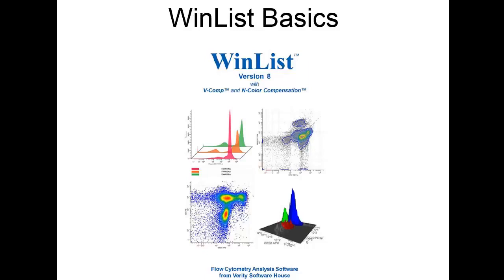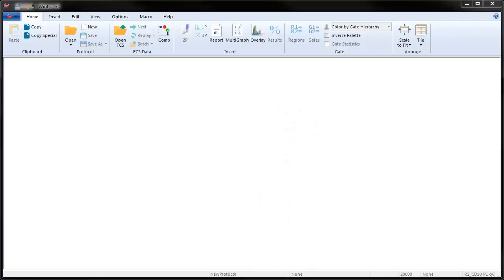Opening files, creating histograms, drawing regions and gates, and developing reports are all covered in this tutorial. Let's get started.